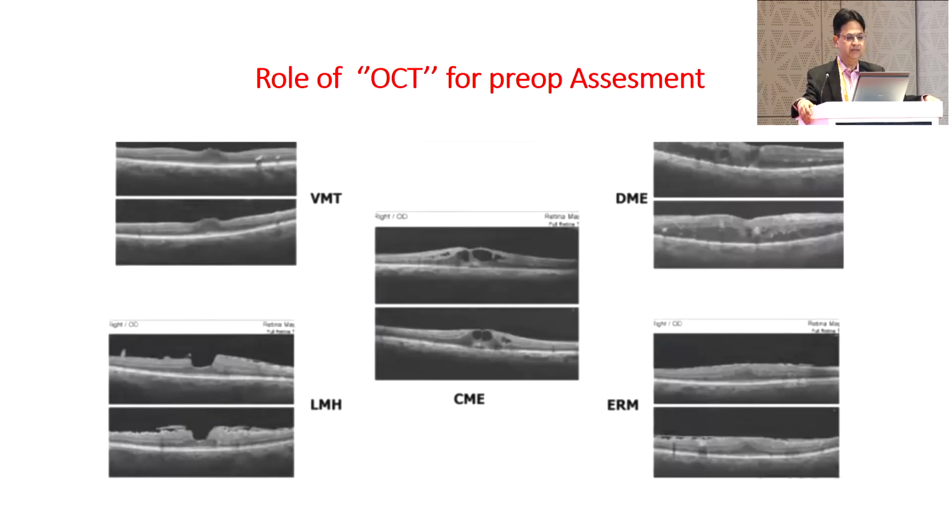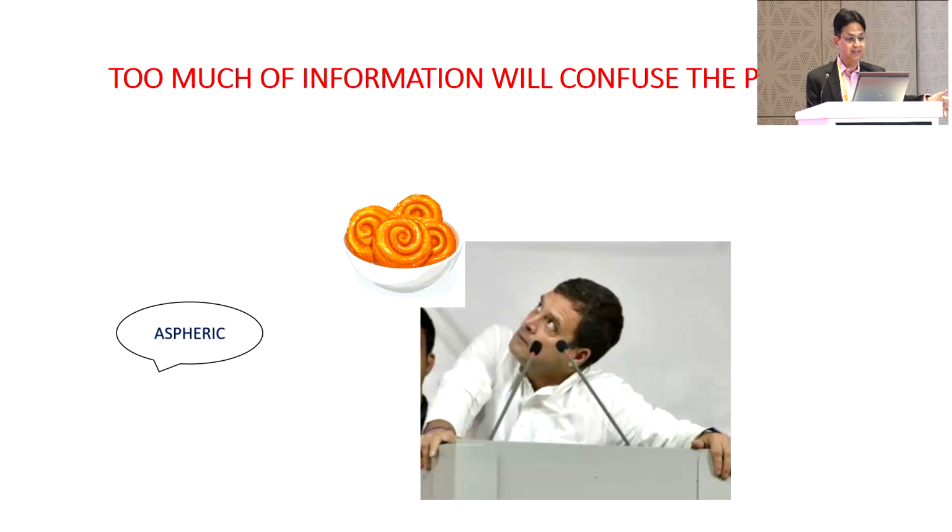Now the role of OCT is very important. Being an anterior segment surgeon, you should go for the OCT even if the patient doesn't demand it, or even if you feel that the patient has no retinal problems. And I would like to stress that you should not shy away from taking the opinion of your retinal colleague if you're going for premium lenses.